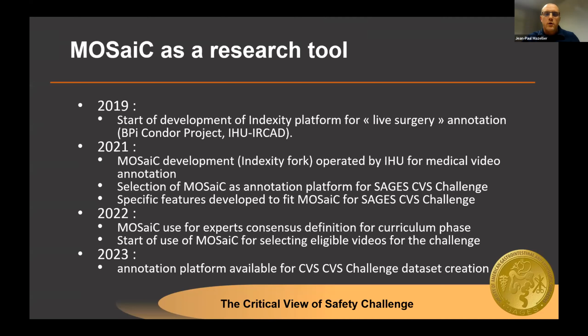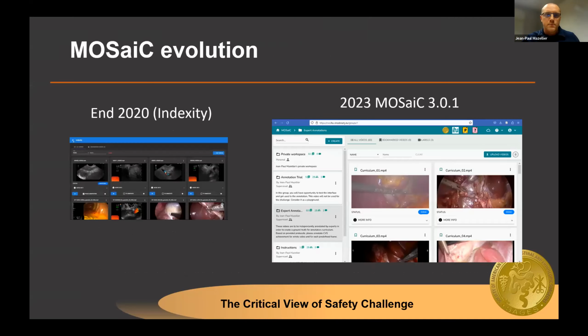Right now, it has been selected as a tool for the challenge. It's used for other projects, so we are building a large experience on top of that. And we hope that it will help the challenge to reach its target to collect a large data set of high quality. We had to provide a lot of evolutions for that. We started from a previous project by the end of 2020, with the basis and seed for this kind of platform. And now we are providing in 2023 Mosaic version 3.